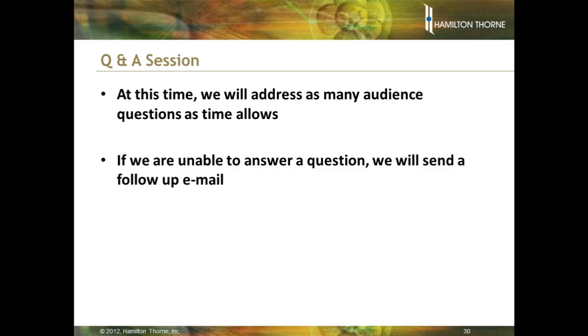Great. Dr. Behr, can you discuss your day 5 versus day 6 pregnancy results? Any problem related to performing biopsy on day 5 and ET on day 6? Yeah. As I mentioned before, my personal preference and bias, and actually better outcomes, drove me to do day 5 biopsy with day 6 transfer.